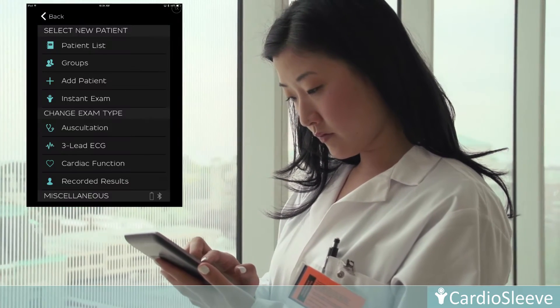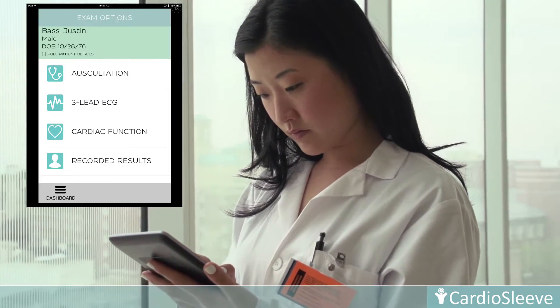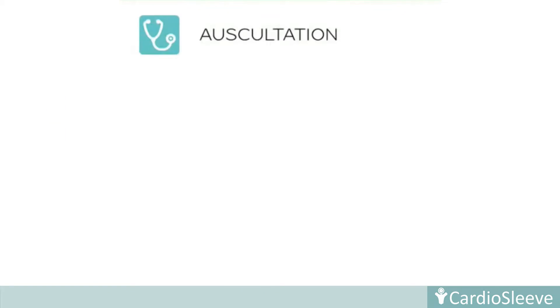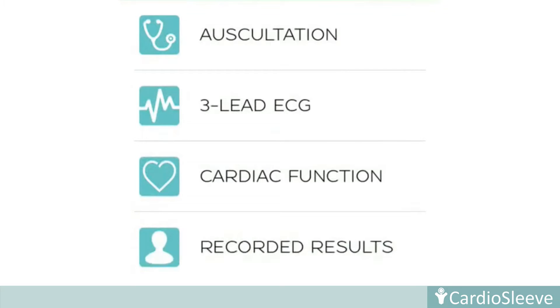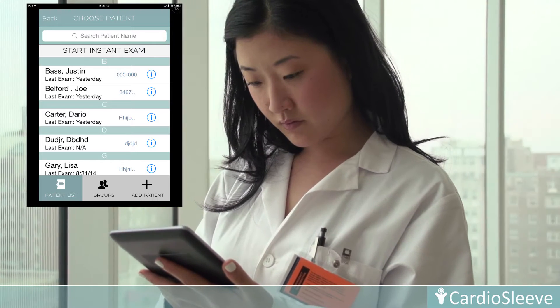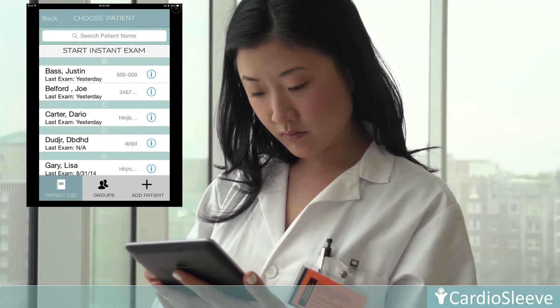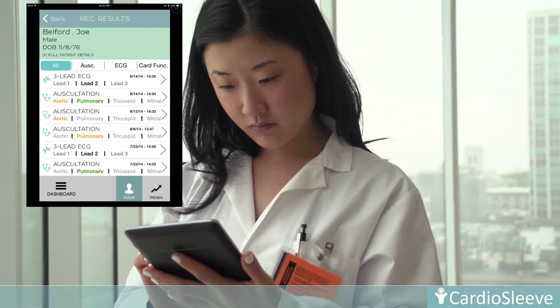CardioSleeve comes loaded with features of tremendous diagnostic and therapeutic value. It has four main modules: auscultation with ECG, three-lead ECG, cardiac function, and recorded results. Once securely logged in, a clinician can begin the recording process by selecting a patient. Patients can be manually entered or selected from a preloaded list.